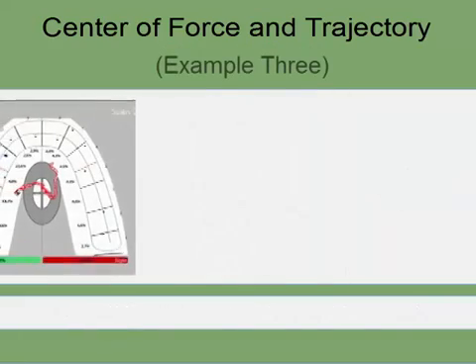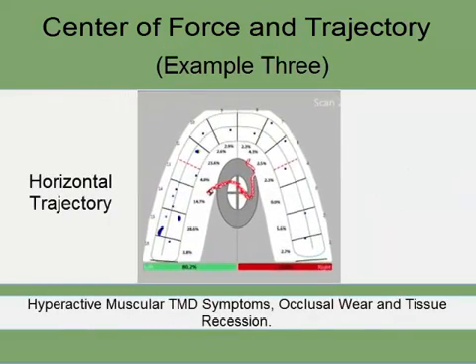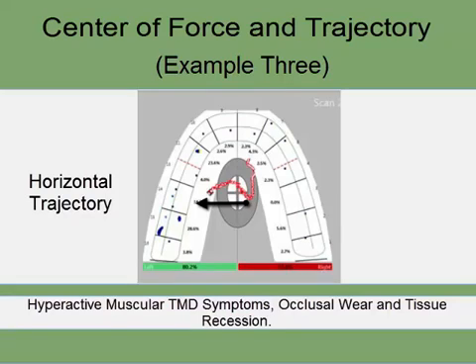The third example shows group function because the anterior guidance fails to disclude the posterior teeth. The trajectory initially moves anteriorly left and then turns downwards towards the posterior left teeth. This may also suggest hyperactive muscular TMD symptoms, occlusal wear, and tissue recession.